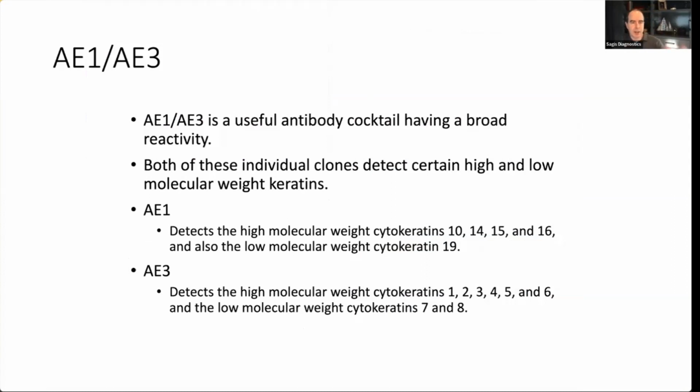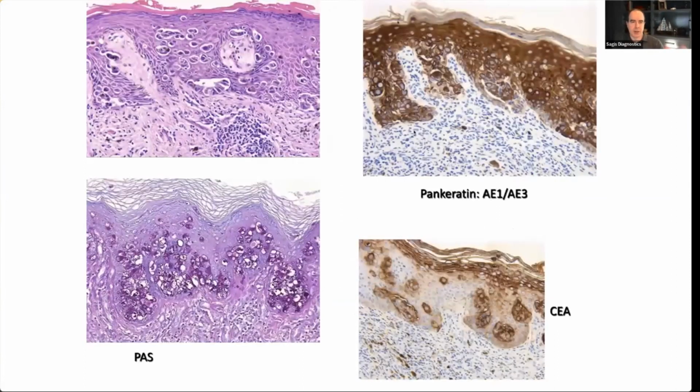So back to the cytokeratins, it's useful. You'll hear pancytokeratin, and we basically do a cocktail of AE1, AE3. And this is what it looks like. So pancytokeratin is going to stain keratinocytes and carcinomas.